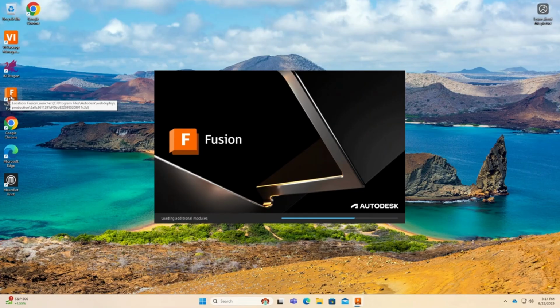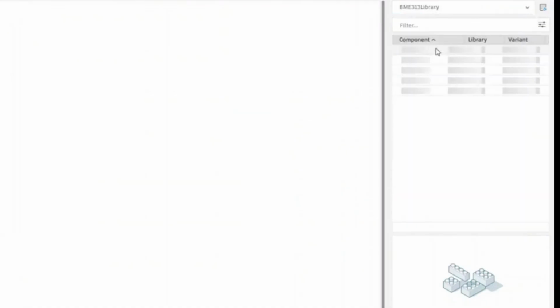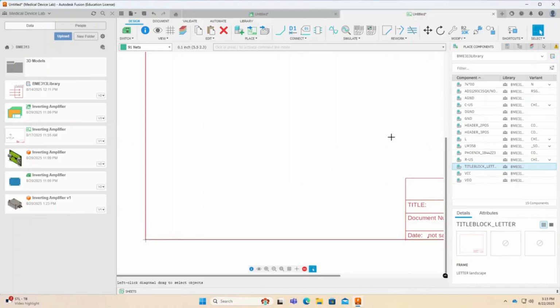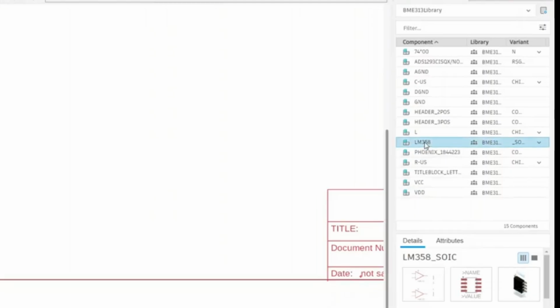Start by launching Fusion. Then create a new schematic. Set the active library to BME 313. We'll begin by placing the schematic title block, followed by all required components. This design uses two op-amps. The LM358 contains two op-amps, so select that device and ensure the package is the surface mount version. Place both op-amp units on the schematic.